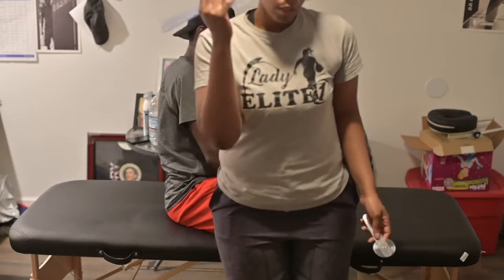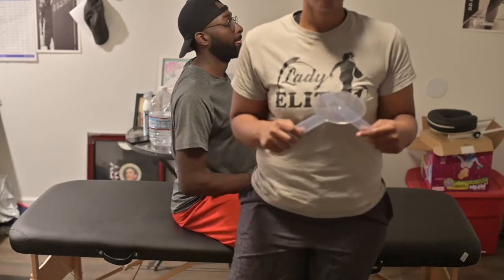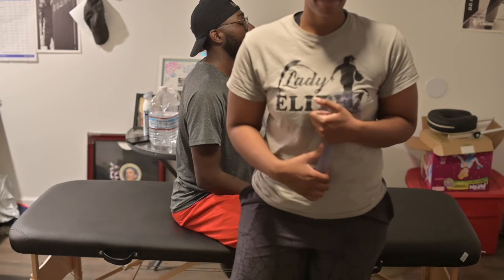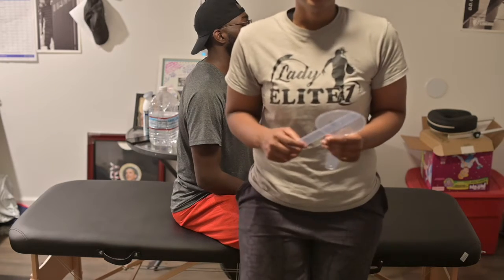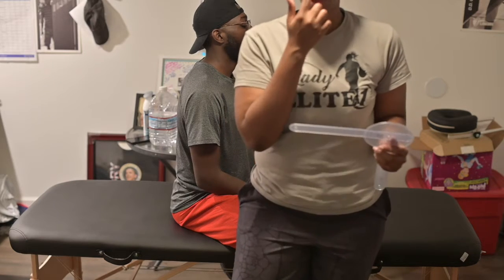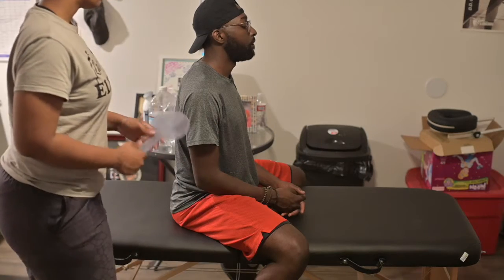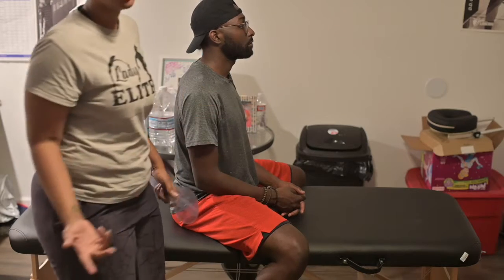The axis of rotation using the large goniometer will sit at the external acoustic meatus, and the mobile arm will align at the tip of the nose, also referred to as the nares, and the stationary arm will be perpendicular to the floor. So here is our external acoustic meatus, and there's the tip of his nose, or the nares.